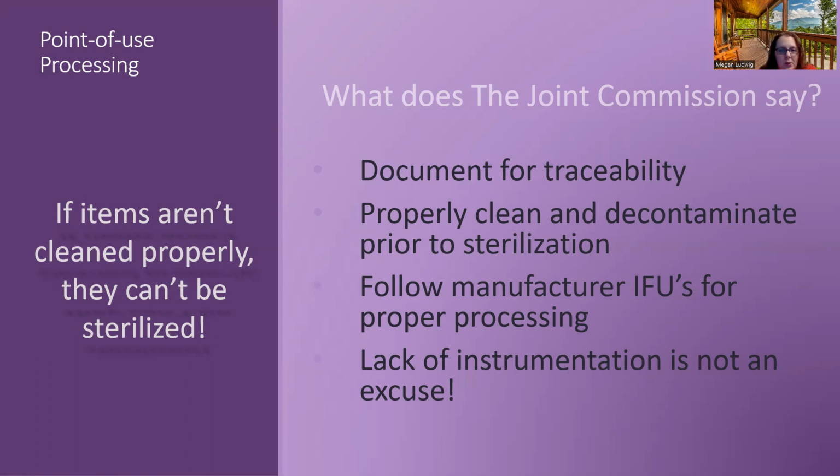The patient gets an SSI, we can trace it and see what happened. Again, you're going to properly clean and decontaminate prior to sterilization and follow IFUs. And again, lack of instrumentation is not an excuse. You can't just be lazy and not want to go through the longer traditional steam sterilizer process. You can't use that as an excuse to use your IUSS.